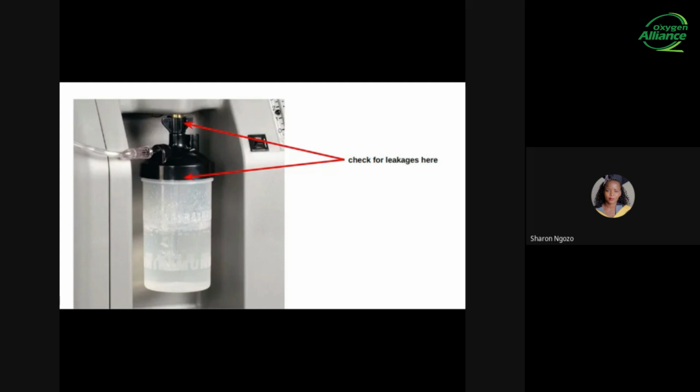As this is happening, it gets hot. We know that we have fans in the concentrator that cool off the compressor. Some of the fans are installed inside so that they can remove hot air from inside to the outside, and some are positioned in a way that they take in cool air from outside into the concentrator.